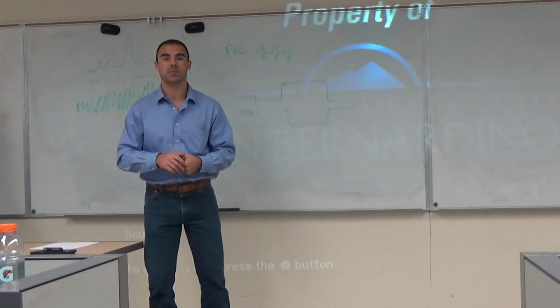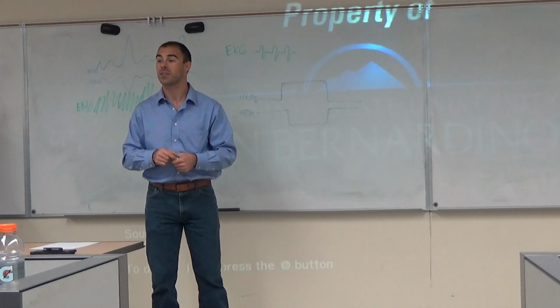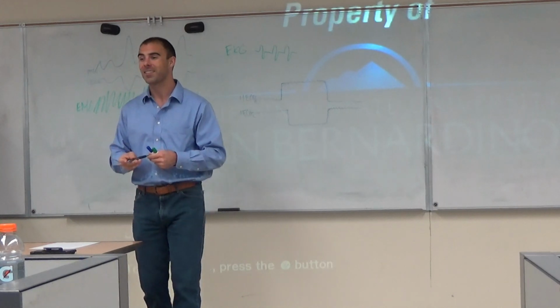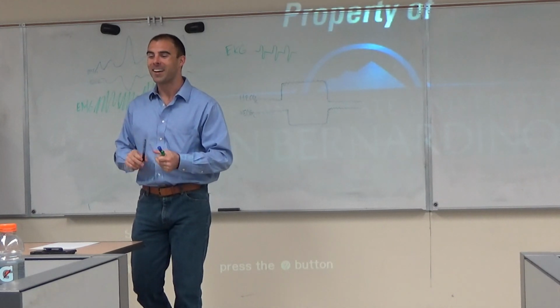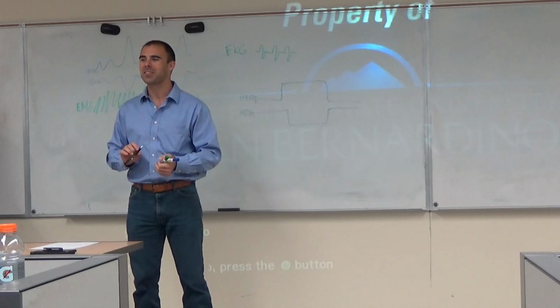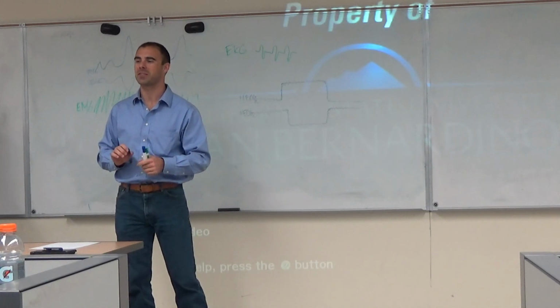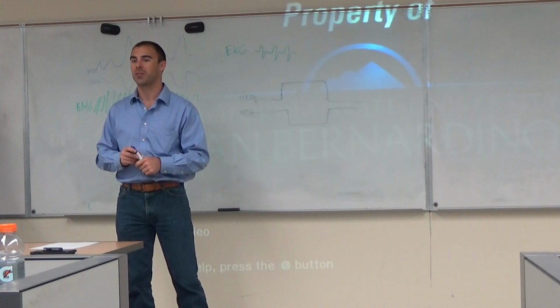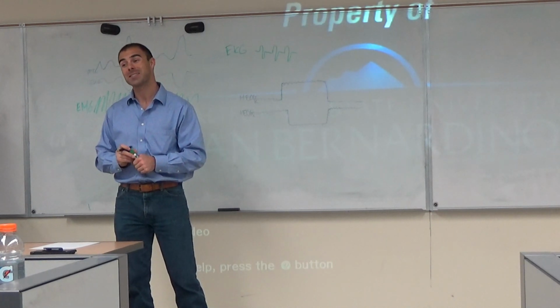Any other artifacts? Yes? Didn't you say something about alpha, like at the end? I didn't write it down, I remember you saying alpha, so I wrote alpha, but I don't remember why. I said alpha is kind of a little bit of both. Some people consider it an artifact if it's not really what they're looking for, because a lot of times it might reflect basically when you're about to go to sleep, very drowsy and things like that.